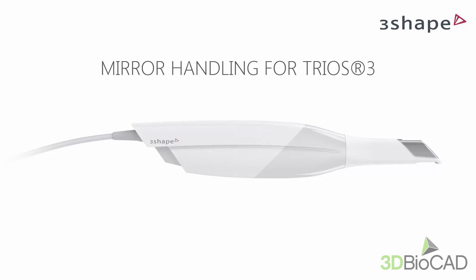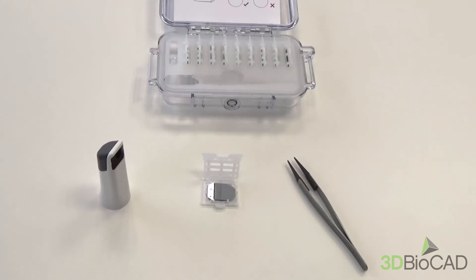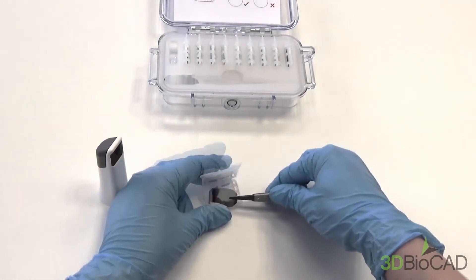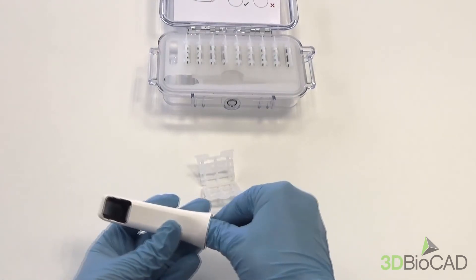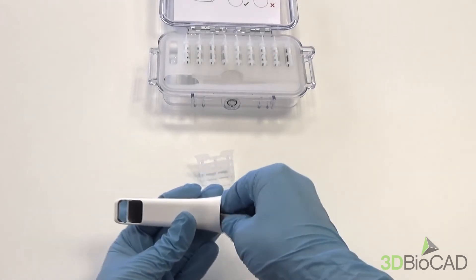Let's see how to handle the mirror on the TRIOS 3 tip. Before doing anything, make sure you have read the instructions enclosed in the TRIOS delivery box. To insert a mirror inside the tip, use tweezers and slowly slide it into the tip. To place it correctly, you can push the edge of it with the tweezers.